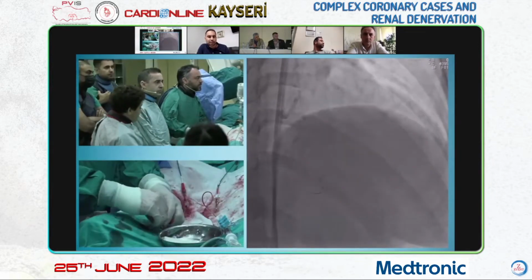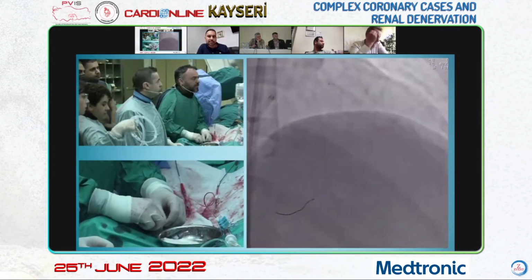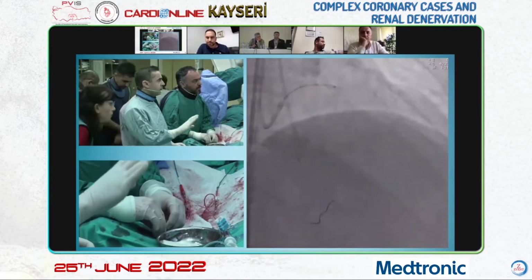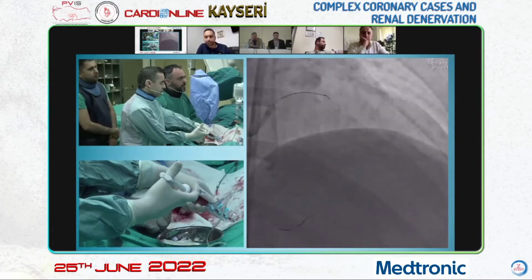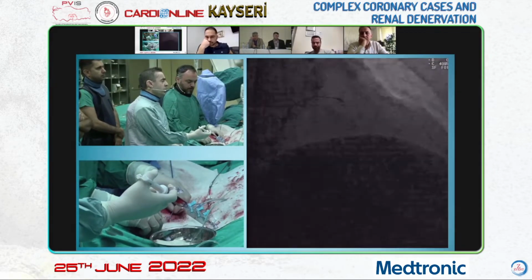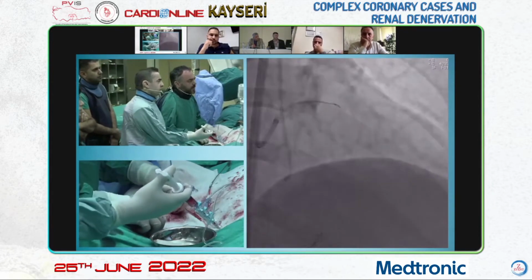Proximal tip is seen. Yes, there is dissection. The lesion is long. And from the RCA to the collateral, there seems to be a subtle connection. I think antegrade will be successful. Which microcatheter do you use? Corsair and Pilot 200. Can you inform us about the angle? 1 to 2 millimeters, 30 or 40 degrees angle.